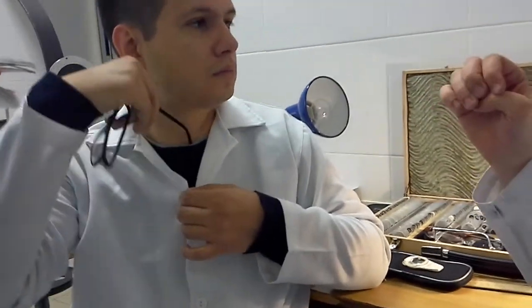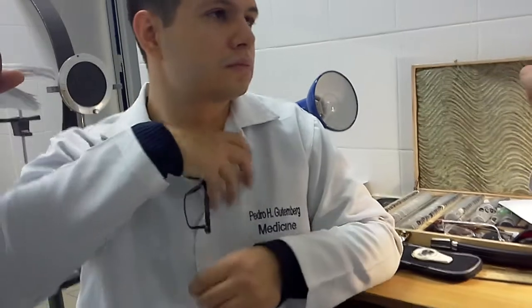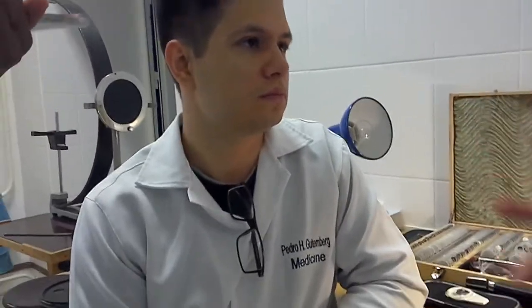Distant direct ophthalmoscopy is based on a very simple and well-known phenomenon — the phenomenon of the red eye. You know what it means: on photos, from time to time, you see a red pupil. Is it good or bad? It's bad for the photo, but it's good for the person. What does it mean when we talk about the red eye in a photo?